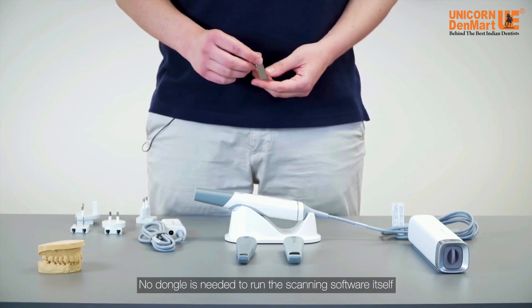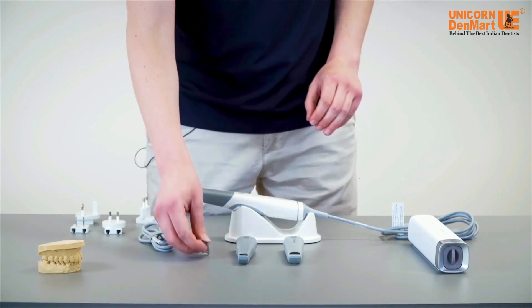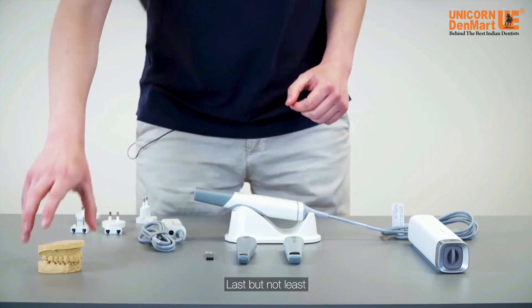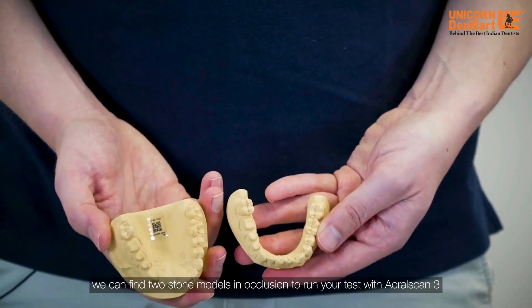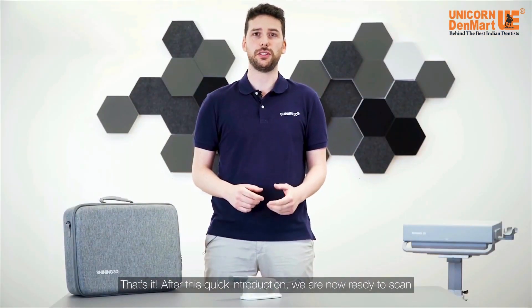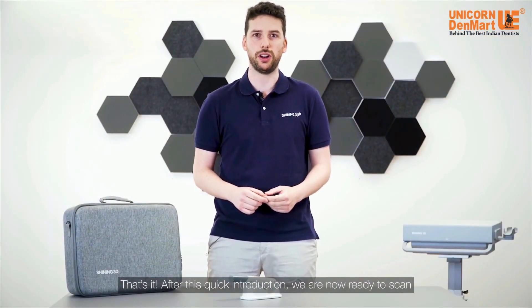The flash disk included is needed just for the installation of the scanning software. No dongle is needed to run the scanning software itself. Last but not least, we can find two stone models in occlusion to run your tests with Aural Scan 3. After this quick introduction, we are now ready to scan.